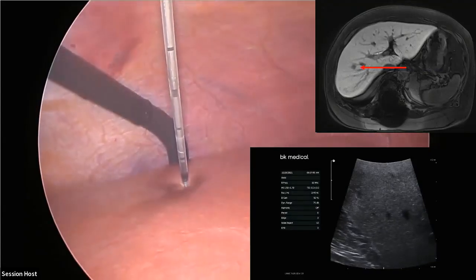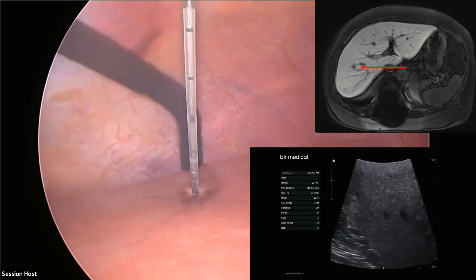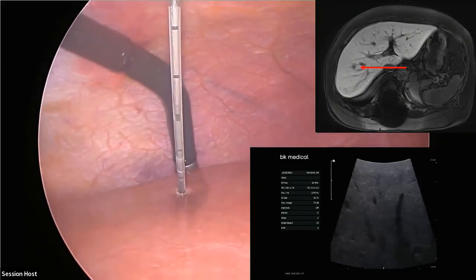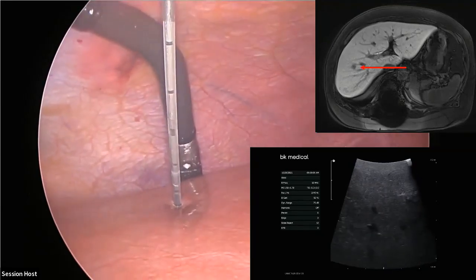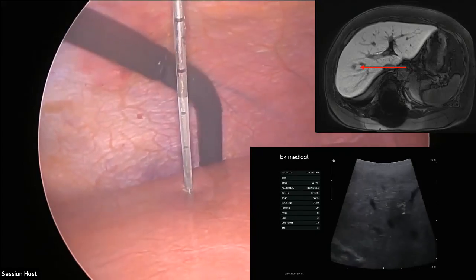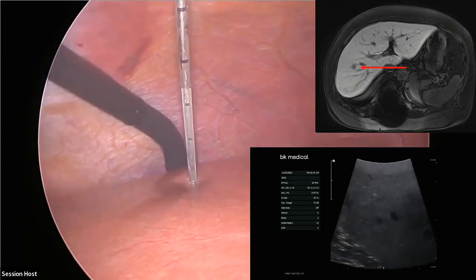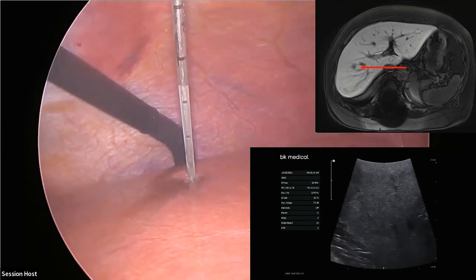So with ultrasound, if you're looking at anatomy, that's one thing. You can hold the ultrasound in sort of a sagittal or axial position, depending on what you're looking for. When you're targeting something, I think it's most useful to, and you're going to see some techniques from experts that are going to be teaching this a little later today, have the ultrasound probe in a way that the needle is parallel to it.